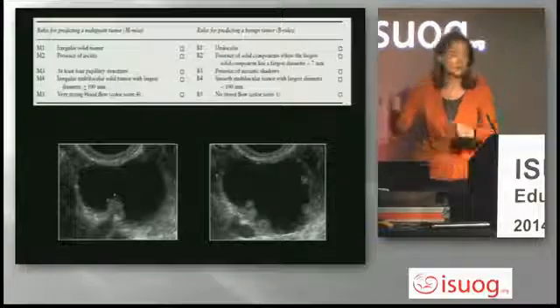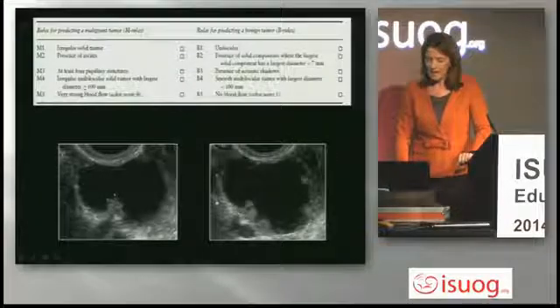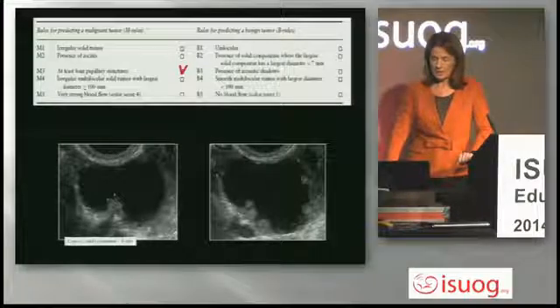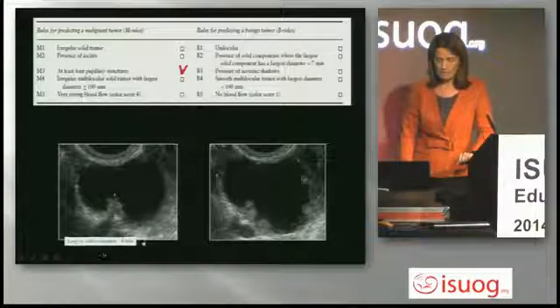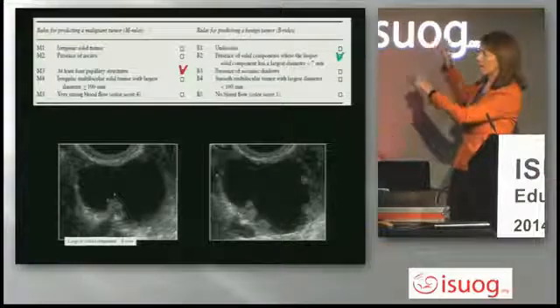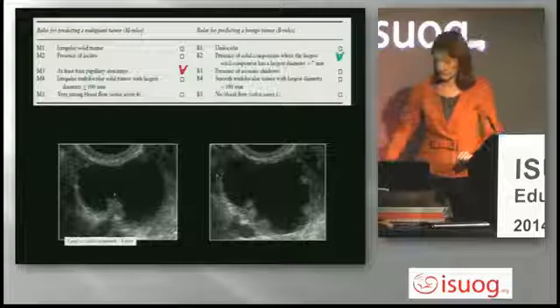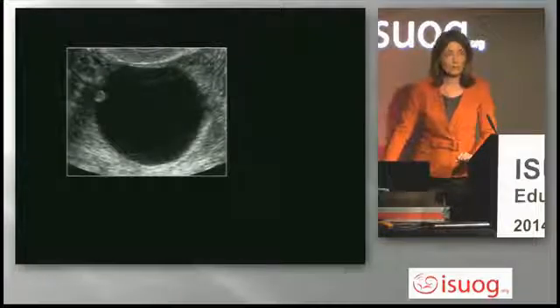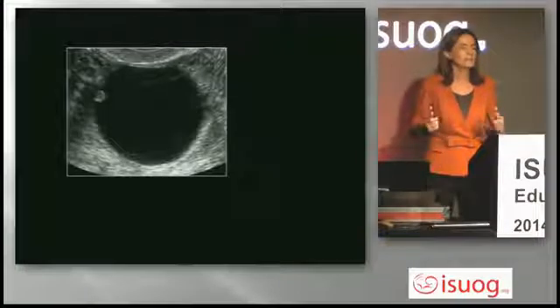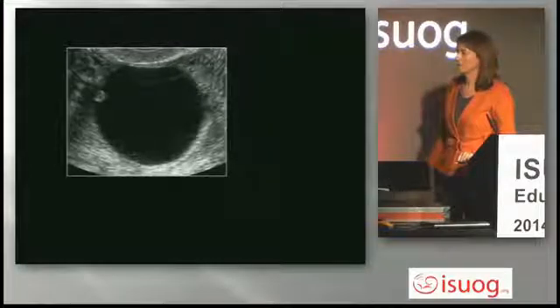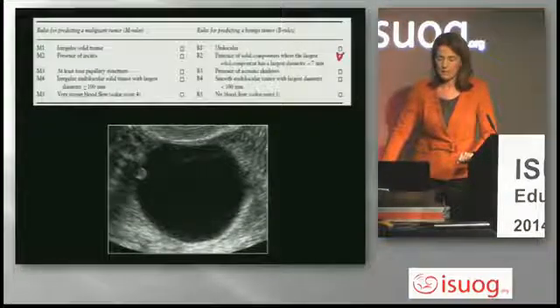The last case: at least four papillary structures present. We can also measure the solid component — six millimeters, so a second benign criterion applies. When we have one malignant and one benign criterion, we cannot apply the rules — not applicable. We have to refer this patient. Another case shows unilocular solid with a papillation of four millimeters; easy descriptors cannot be applied, but simple rules can.